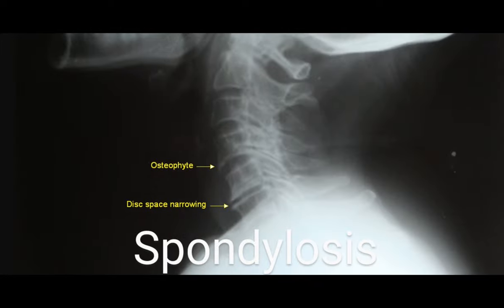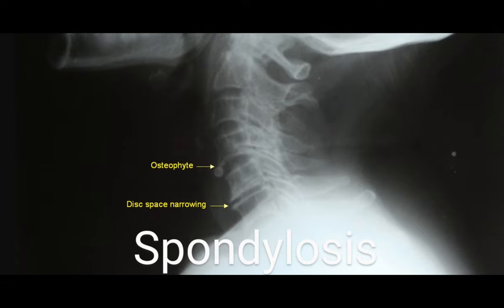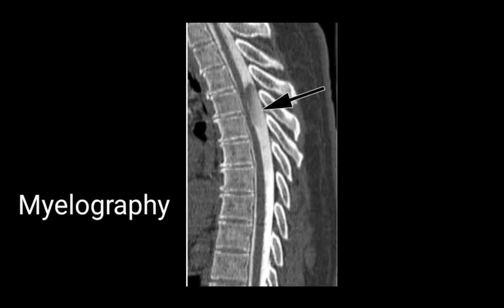The next image shows spondylosis with disc space narrowing in the vertebrae. The disc space is more at some levels but narrowed at others, and there are osteophytes at the corners of the vertebrae — these are known as degenerative changes in the spine.